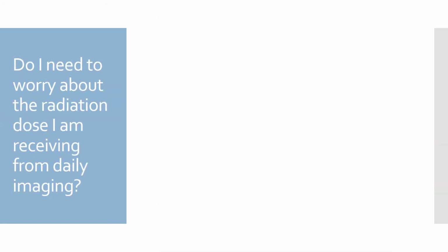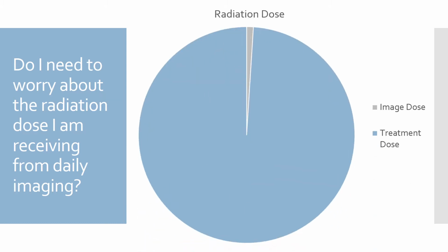It is common for patients to be concerned about the radiation they are receiving from daily imaging. However, a cone beam CT gives a much lower dose than a diagnostic CT. The small dose you receive from imaging is accounted for in your treatment plan and is worth ensuring that the radiation is delivered exactly to where your radiation oncologist prescribed it.